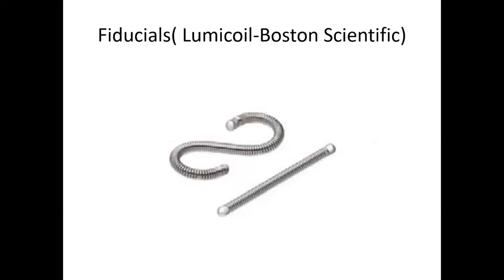These are the fiducials that we use. Remember, I said when a patient is about to undergo a radiotherapy, I gave example of a pancreas, it could be the liver, it could be the lungs. When they want to give radiotherapy, we want to avoid radiation going towards healthy tissue. So we want to mark, actually we are just using them as markers. So the endoscope has a provision of having a needle which we can use to insert these markers into that region and leave them there. Then we are giving an oncologist some boundary in which to shine their radiation as they give treatment to their patients.